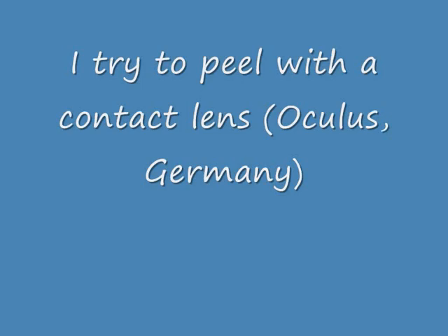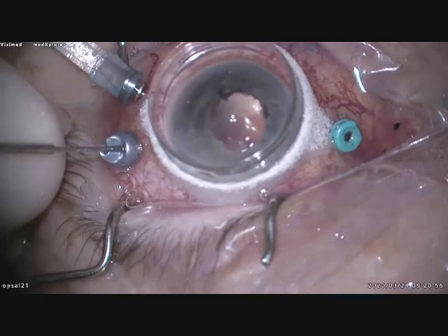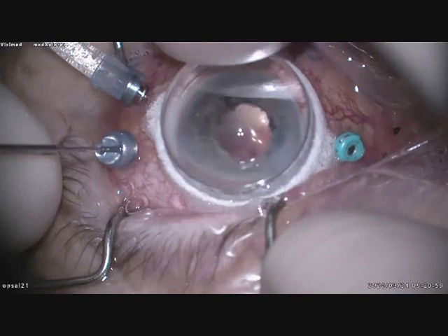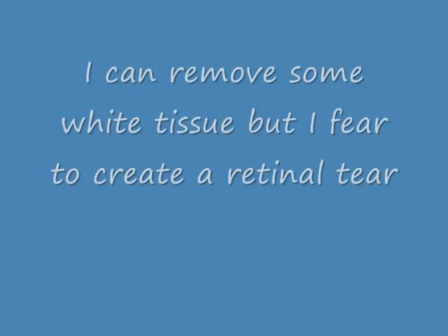This is a contact lens from Oculus, Germany. I try to repeat the membrane peeling with higher magnification, and here I am removing some white tissue at the inferior pole. But I fear that I will create a retinal tear — the tissue is very, very firmly attached.